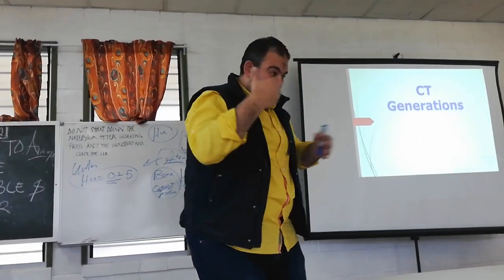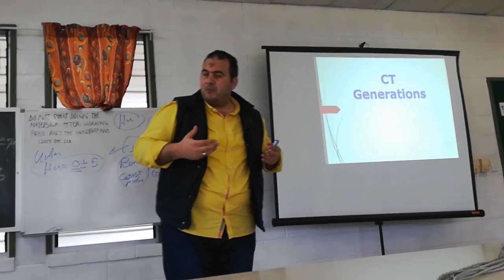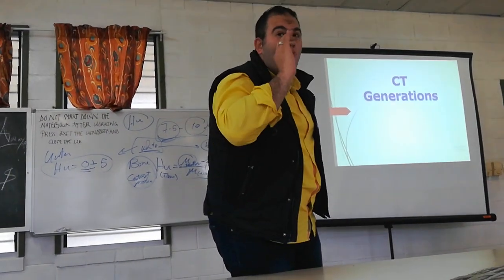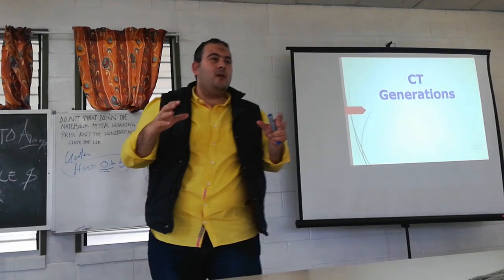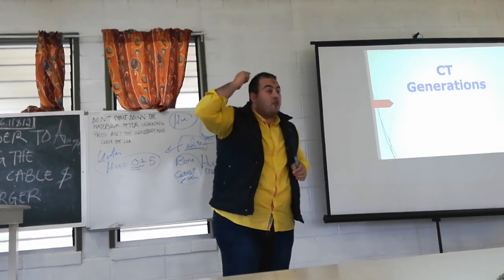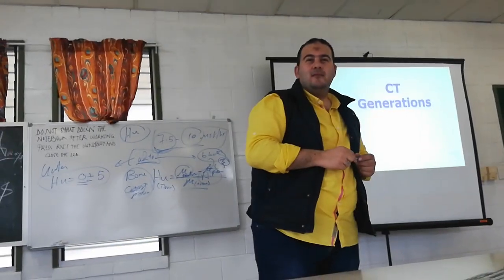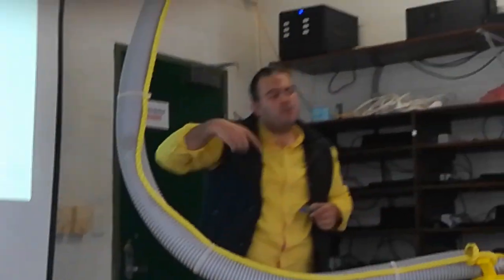Nowadays, some vendors like Philips or Toshiba are producing machines with 640 detectors. So the machine will be very fast. It scans a wide range of the patient in no time. Scan time for the brain is less than 1 second. Can you imagine? Very fast. Reducing the scan time reduces exposure to the patient, with the same image quality, maybe better.